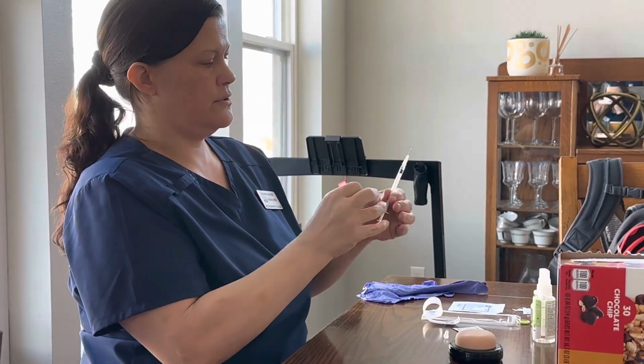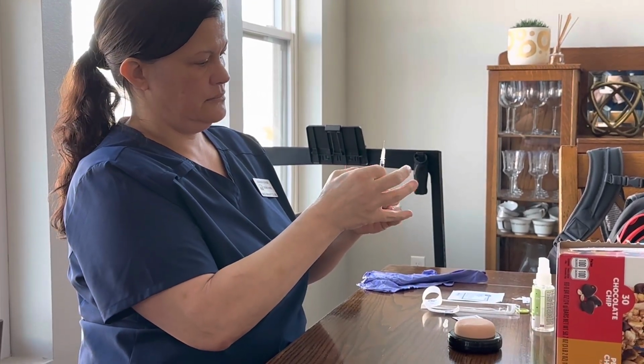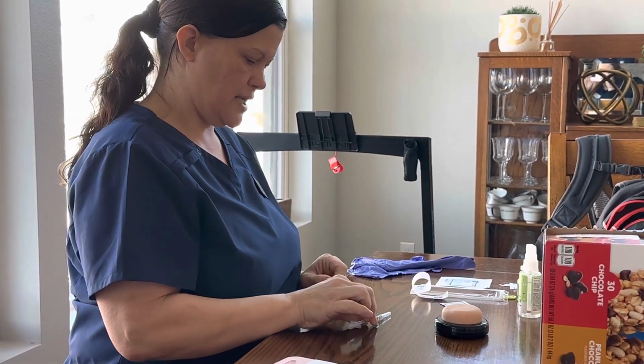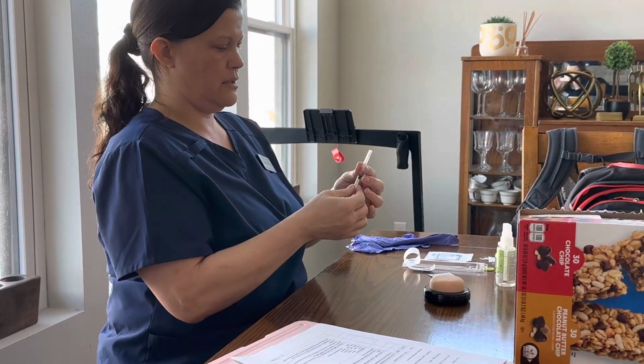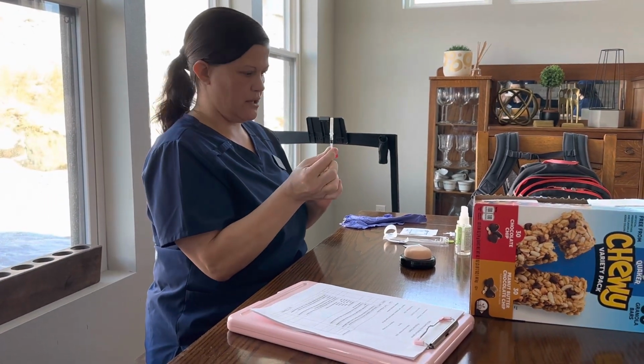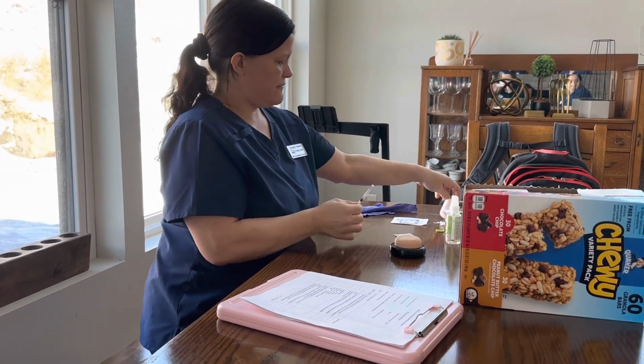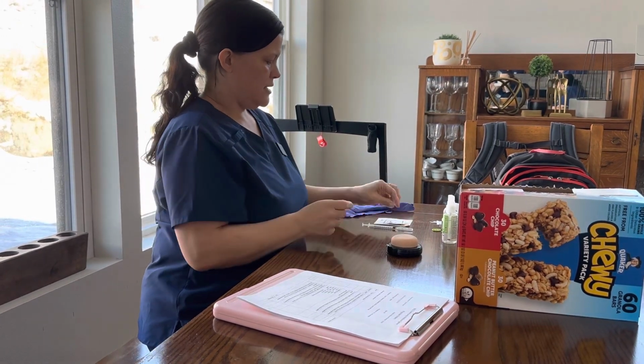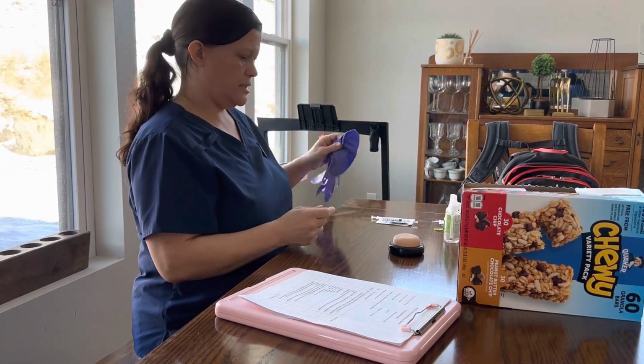And to make sure that there aren't any bubbles in it. And then I'm going to go ahead and recap it using this one-handed scoop technique. Grab it down here and place the needle back on. So now that I have that complete, I'm going to go ahead and grab my alcohol prep, a gauze pad, and my needle, and I'm going to put my gloves on.